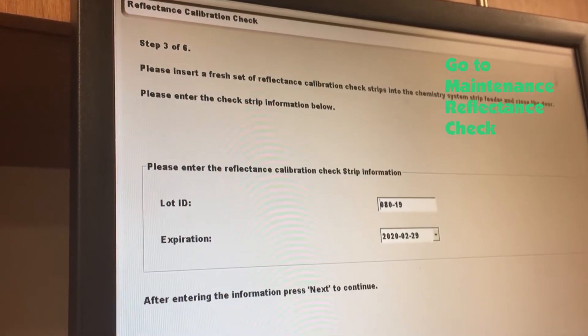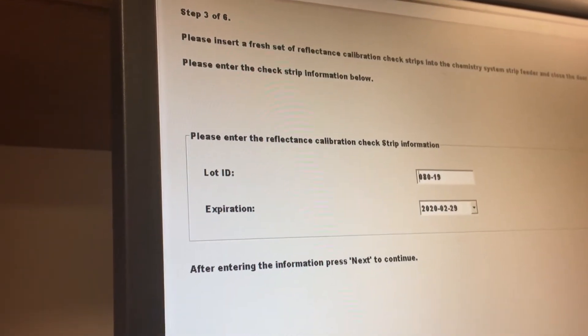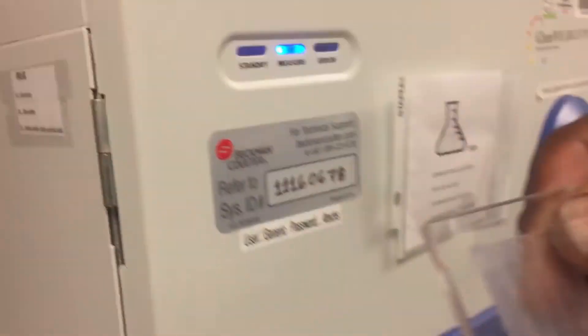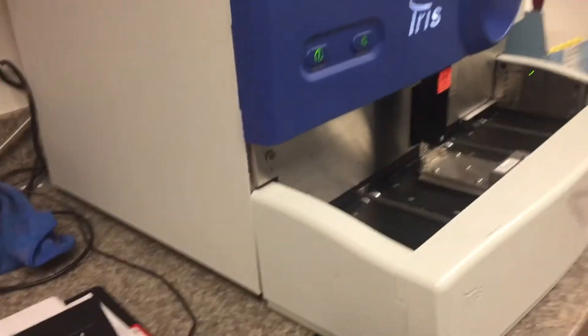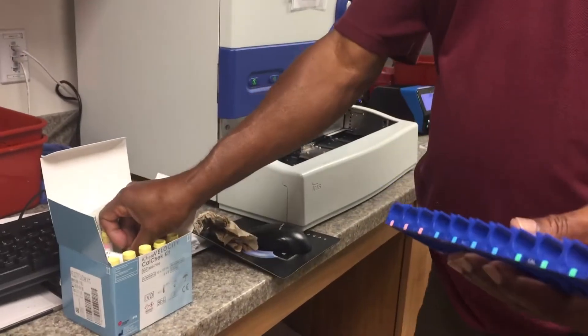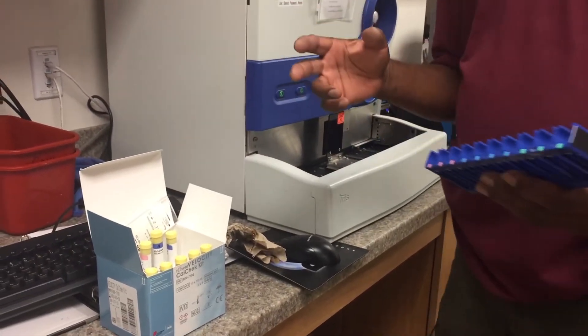We're going to put in the lot number and the expiration date — we're going to come over here. It's going to get the information from the strip, so we're going to put the lot number in. So the second part — you're putting the strips in for the first part. So you do that first.